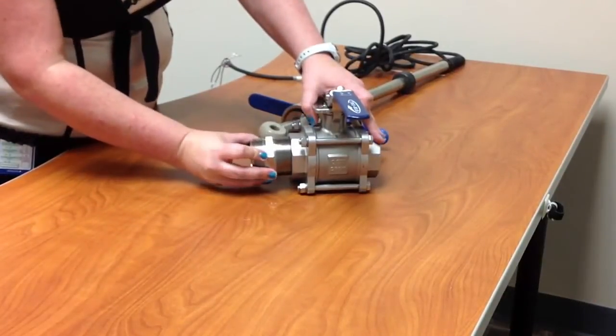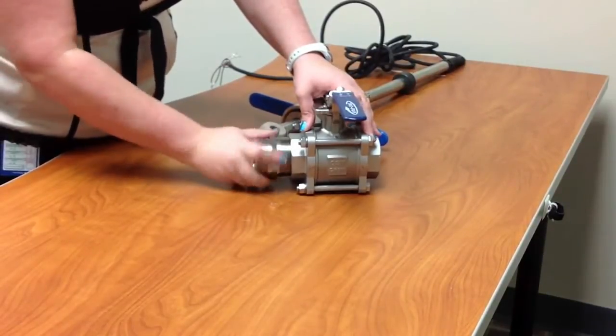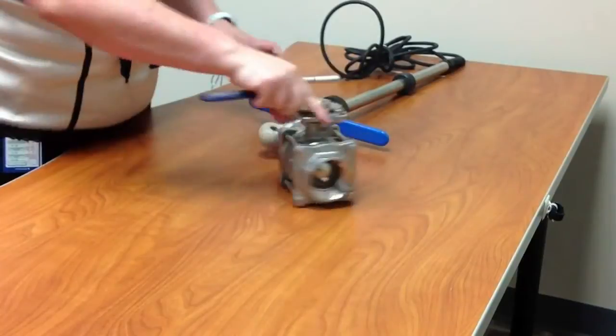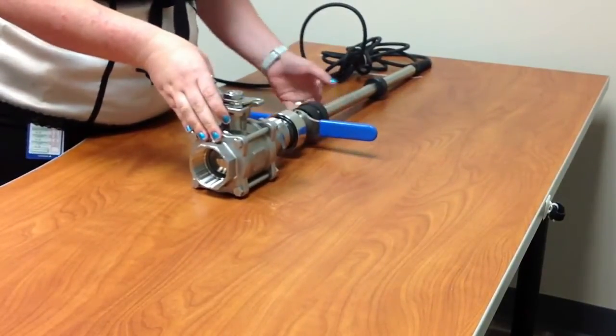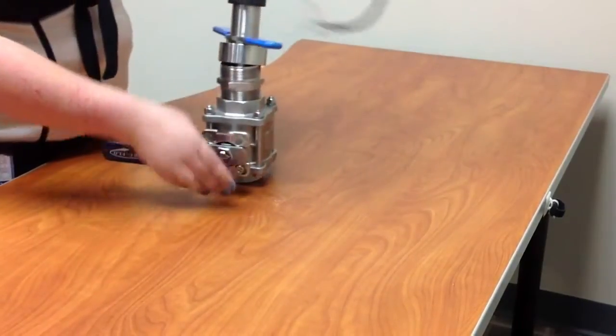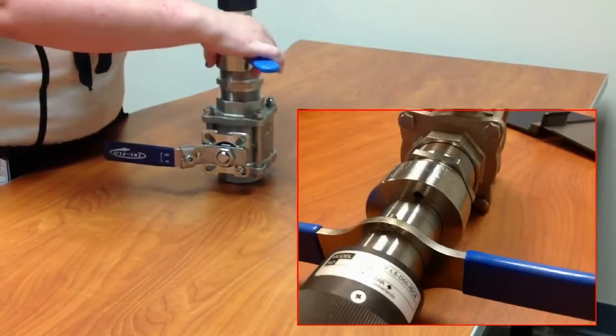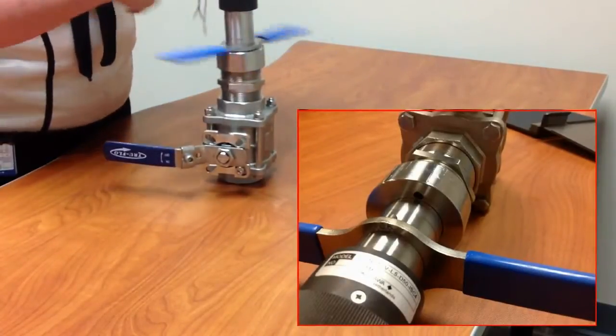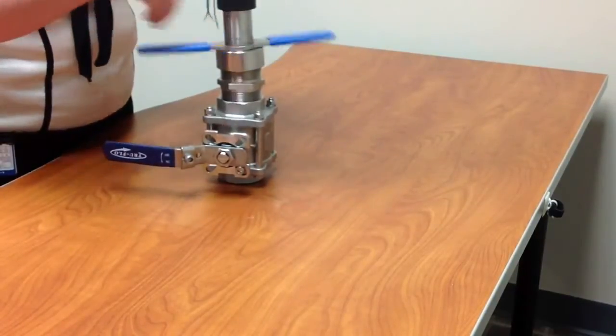Basically, your ball valve's in the off position, and you will thread the process adapter into your ball valve. Then you put your PR-10 onto your process adapter, line up the notches on the T-handle and the nut, and thread the nut onto your process adapter to lock it on there.